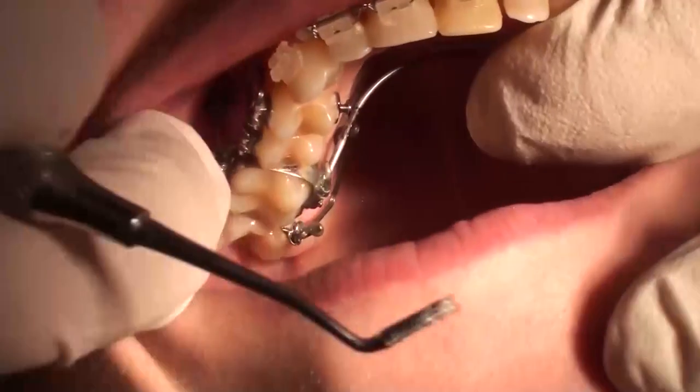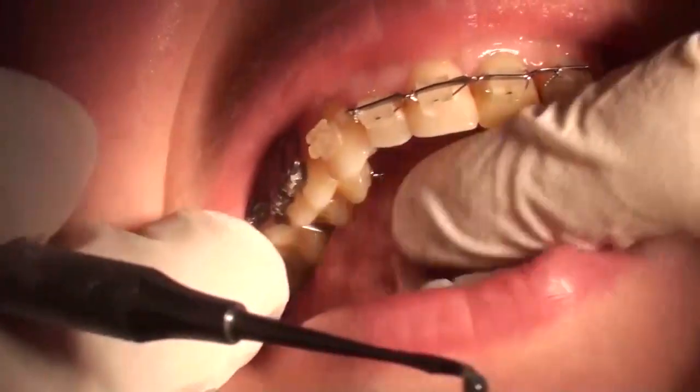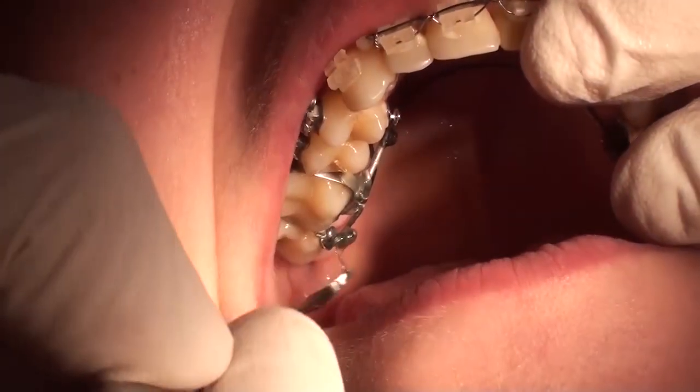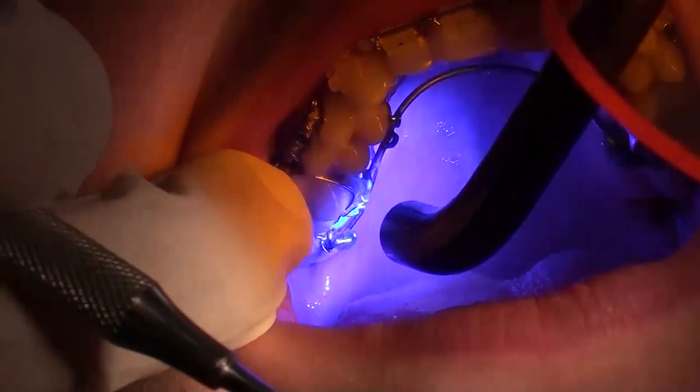Finally, some Trigel is applied to the ligature of the cantilever to prevent any discomfort for the patient.